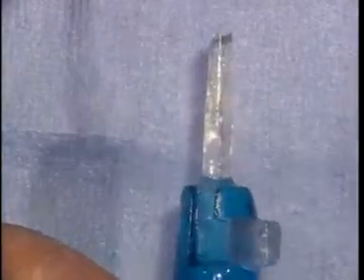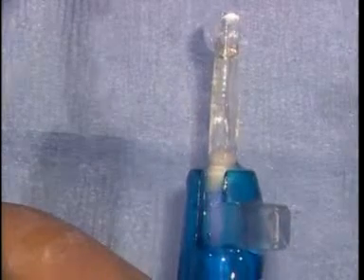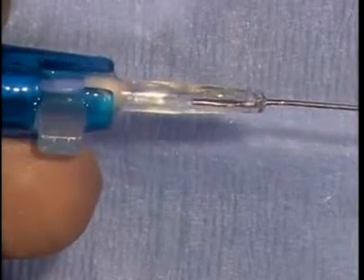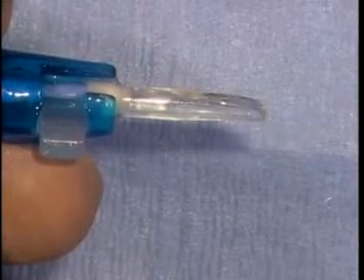Advance the plunger until it is in contact with the lens. The final lens position should be within approximately 2 millimeters of the end of the cartridge. Evacuate any air bubbles from the loaded cartridge with methylcellulose-type viscoelastic injected into the tip of the injector using the cannula to backfill the cartridge.